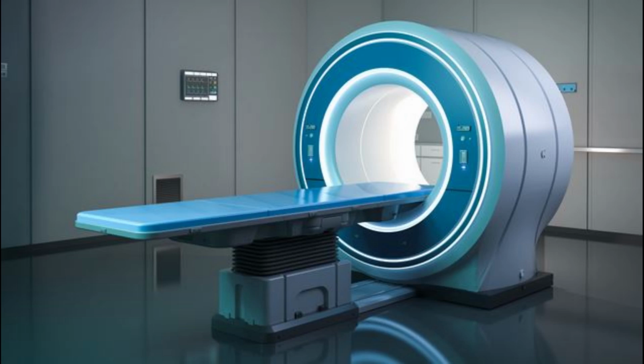MRI machines can produce loud noise, up to 120 dB. This can cause hearing loss, tinnitus, and hyperacusis, so appropriate hearing protection is essential for anyone inside the MRI scanner room during the examination. Medical societies issue guidelines for when physicians should use MRI on patients and recommend against overuse.